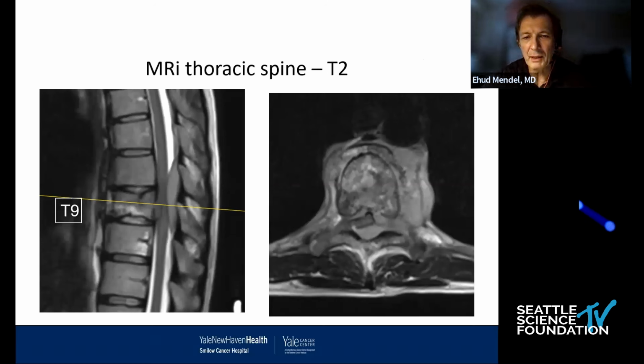This is the MRI, and you can see on the MRI there is something going on. There's a mild fracture at T9. There is a severe spinal cord compression. There's no cancer diagnosis. This is a patient who just showed up in the ER, and as you go into your practices, you're going to see these types of patients show up to the emergency room, and you have to know and figure out where you're going to go from here.